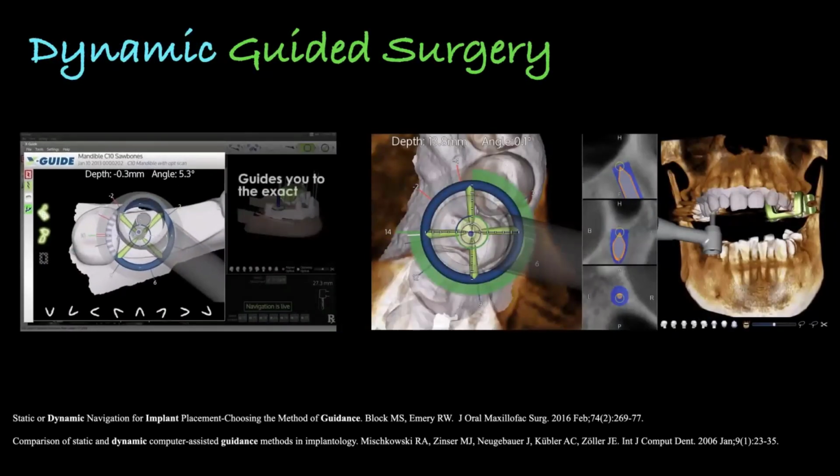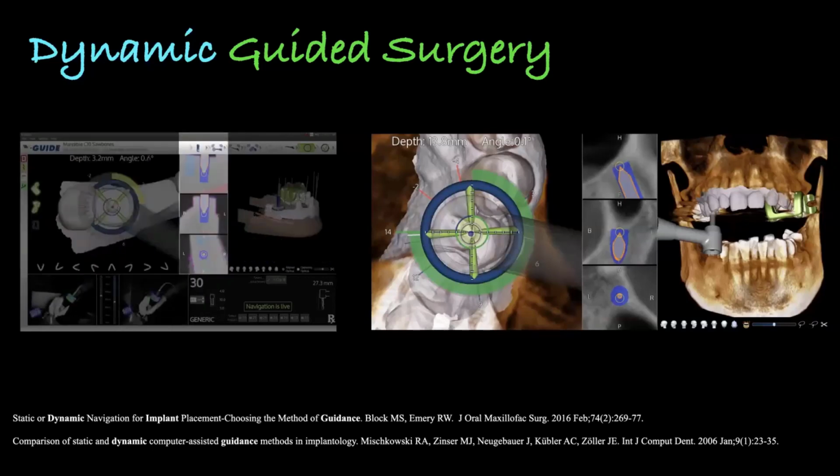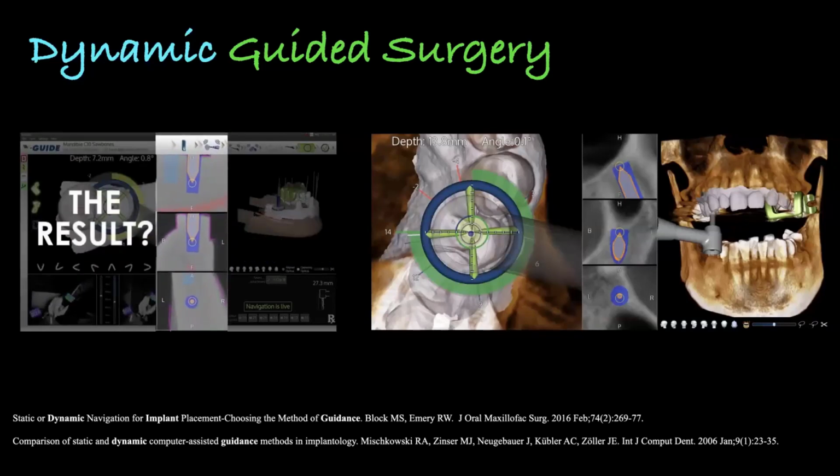The other way to do this is through real-time guided surgery, what we call dynamic guided surgery. Now, dynamic guided surgery is pretty awesome. I tell people it's like having a GPS for your handpiece. You know at all times where you are in 3 dimensions in someone's mouth when you're drilling an osteotomy or when you're about to place an implant. And you plan this. The beauty of this is, unlike static guided surgery, there isn't another lab step that's needed. You can just scan them and go and do the work and utilize it.